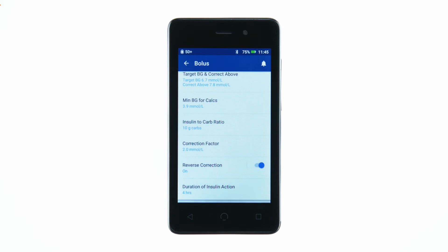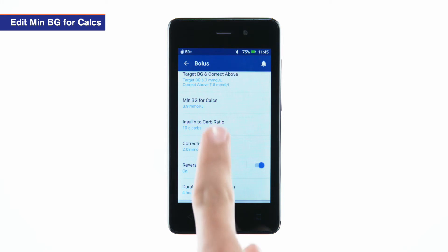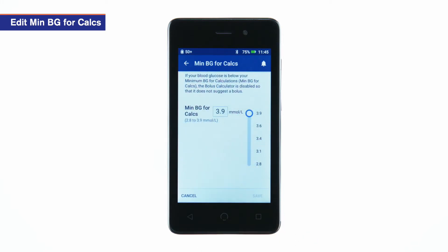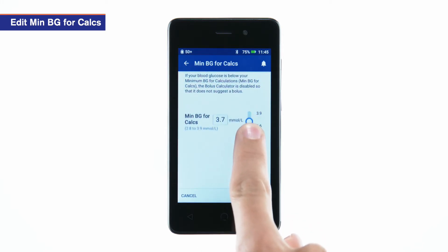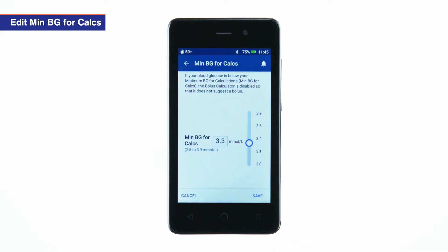To edit the minimum BG for calcs, tap min BG for calcs. Using the slider, enter a minimum BG value. Tap save.